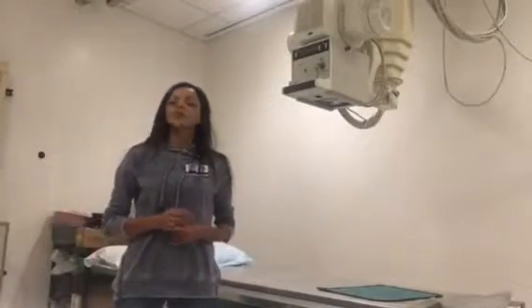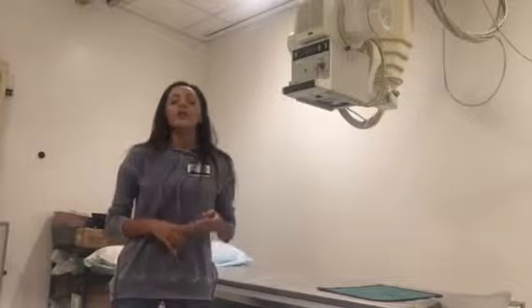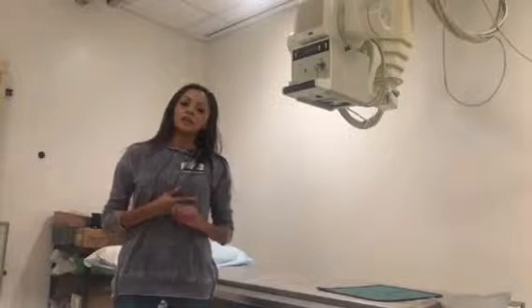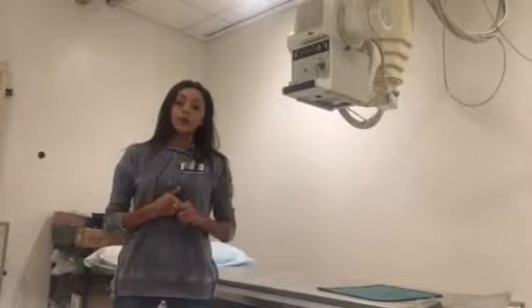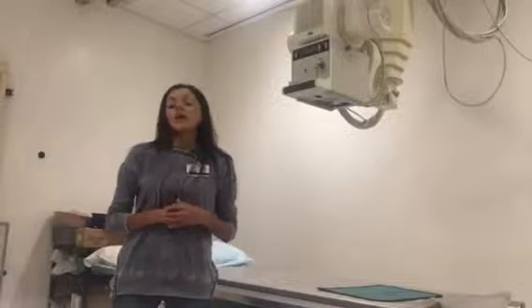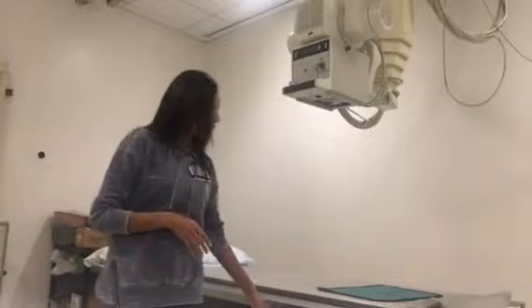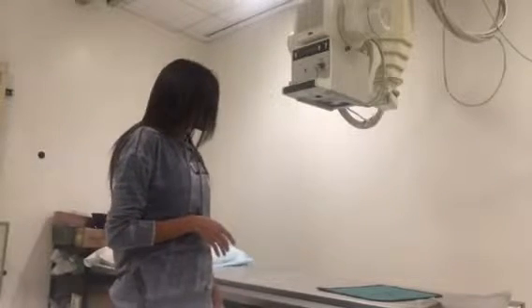Okay, so today we're going to be doing a knee trauma series. I'm going to be doing an AP, an oblique with medial rotation, a lateral. I'm also going to be doing a Béclère and the Settegast. Okay, so I am detented to my table Bucky. I have an IR in the table Bucky, and I'm at 40 inches.